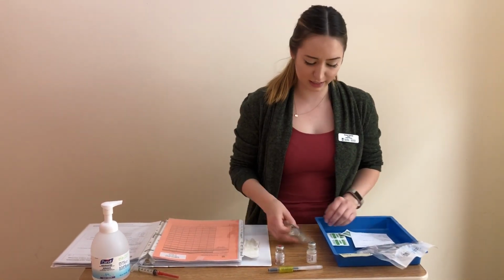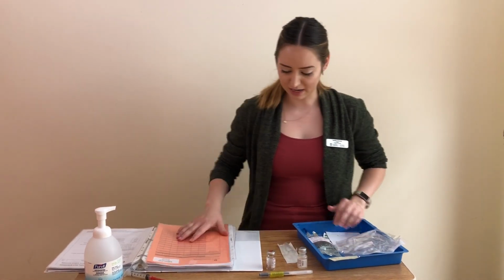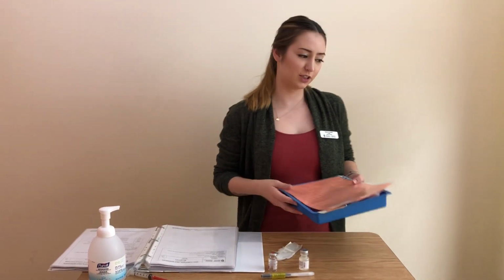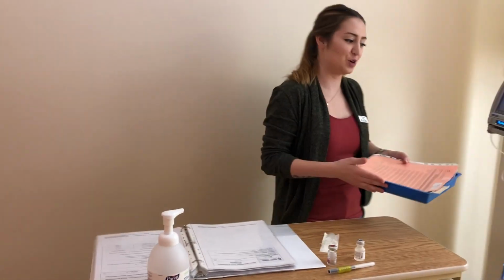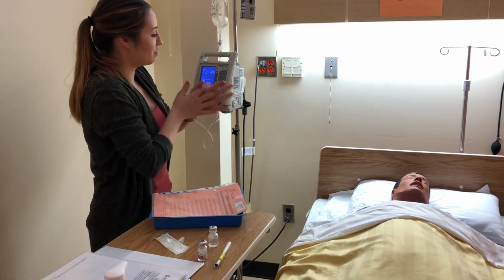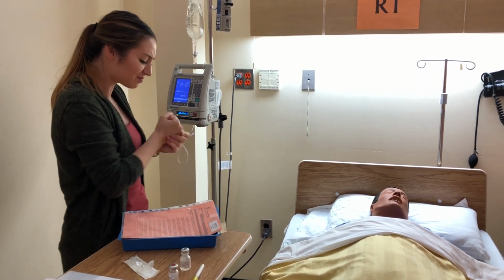I need my drug, my secondary line, my MAR, and some alcohol swabs. So I'm going to head over to the room, perform hand hygiene as I enter. Hi Emma, I'm Savannah. I'm a student nurse and I'm here to give you your methylprednisolone.